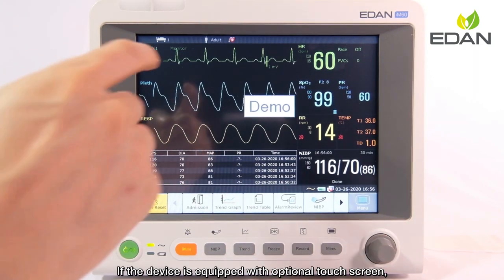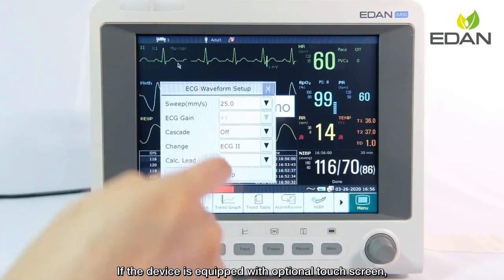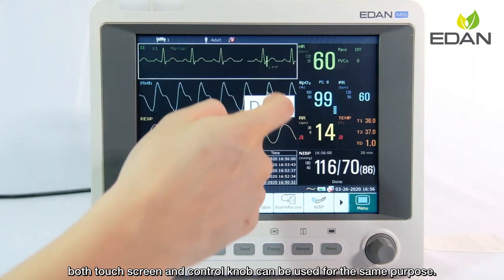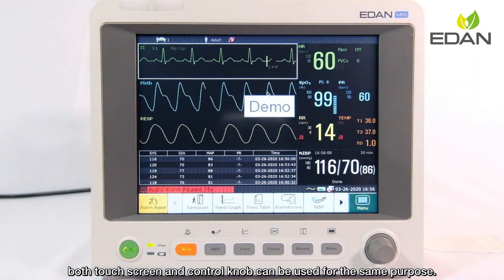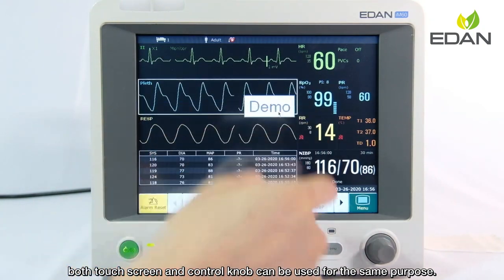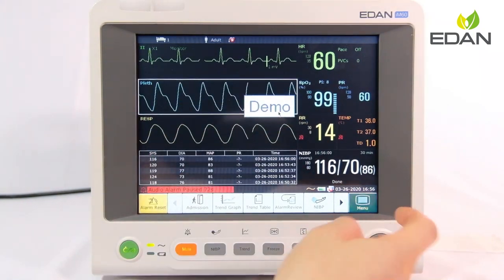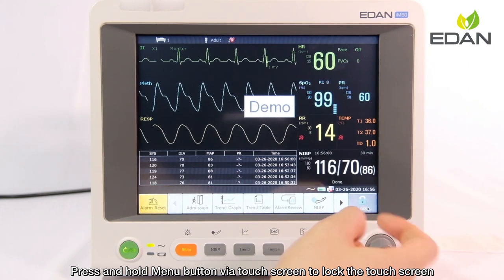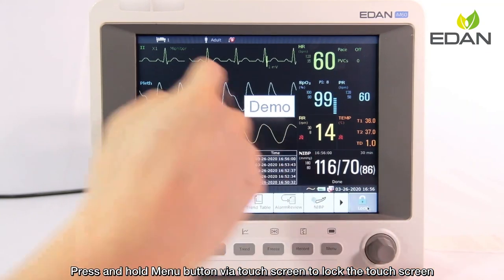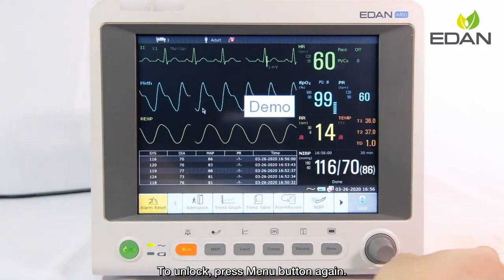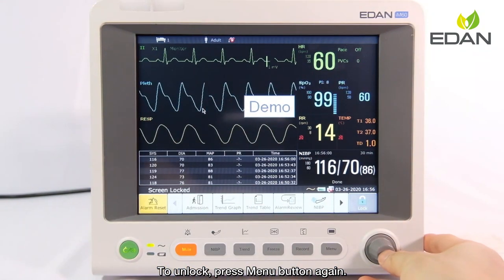If the device is equipped with an optional touch screen, both the touch screen and control knob can be used for the same purpose. Press and hold the menu button via touch screen to lock the touch screen; press the menu button again to unlock.